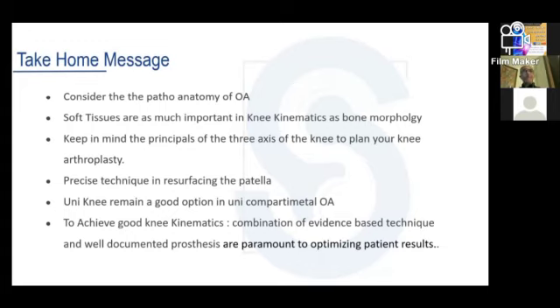From your experience, what do you think about the long-term outcomes of high flexion total knee replacement? Actually, it is not only my experience but the data which is available, because the high flex knee has a very good outcome at the moment. The high flex knee is used a lot in Asia, mainly because people are used to sitting down and kneeling in our environment, because people are praying.